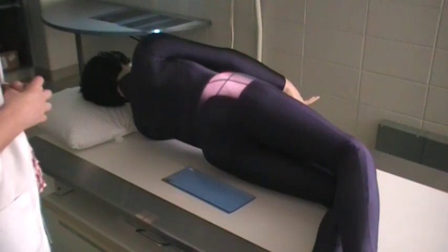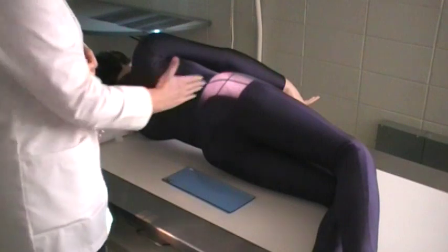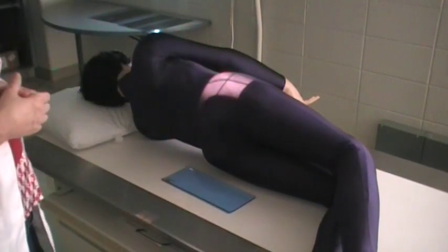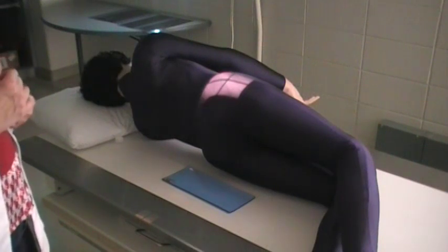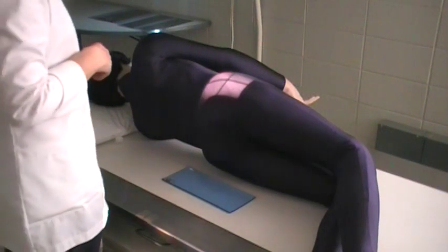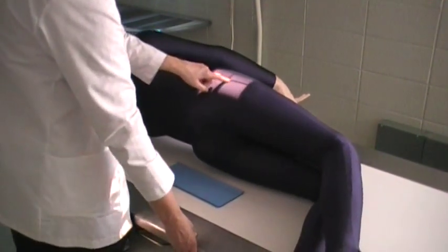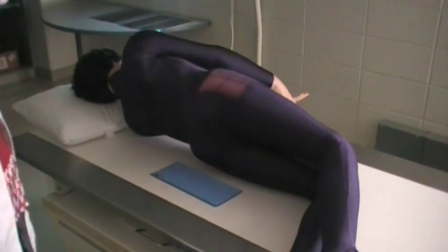This is our lateral sacrum. It will also include the coccyx, but the coccyx will be at the most inferior aspect of your image. If you want to have the coccyx centered on the image receptor, just come inferior 2 inches and you will be centered directly over the coccyx.